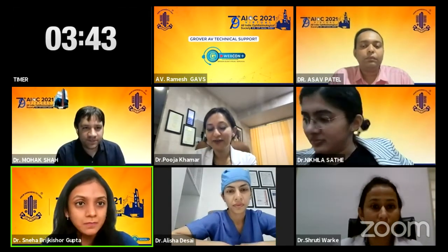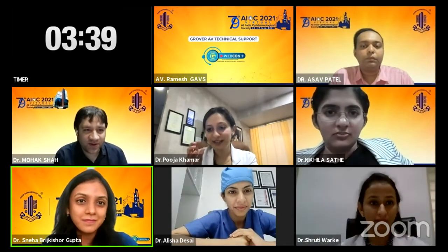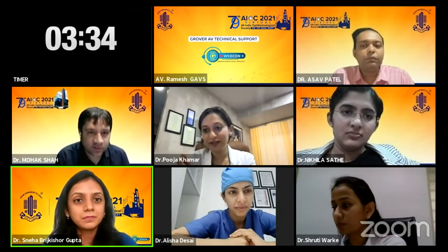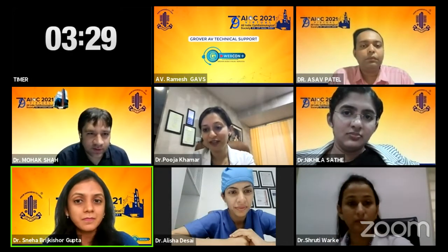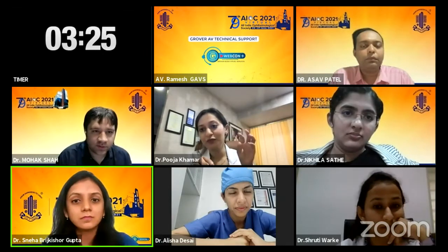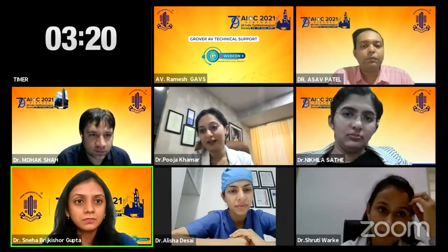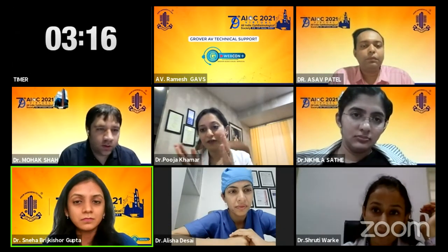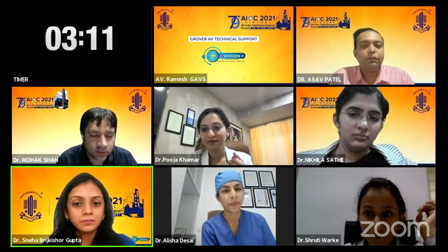Recently we got the MEL 90, Dr. Mohak. So I want to ask you, they showed that there is a PTK mode where you can go from 2 millimeters to 8 millimeters. I wanted to discuss that earlier, but I thought today would be a good time, whether we can do that in Zeiss, because if it's a 2 millimeter zone to 8 millimeter zone, then you can probably customize the treatment with Zeiss. Only thing is, the decentration has to be thought about.